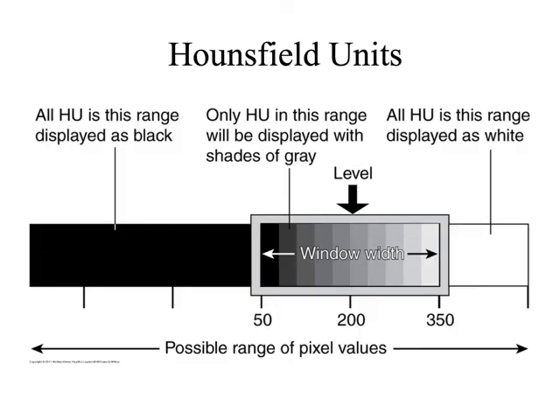I don't want to bog down too much on contrast though, because frankly, contrast is one of the most confusing things we could talk about in CT. Sometimes we talk about iodine contrast, sometimes we talk about image contrast, and I think it's outside the scope of this discussion to really drill down into it. Just know that it's fairly complicated, and we will cover it in depth when we get into CT next trimester. I even get confused talking about contrast, in all honesty.